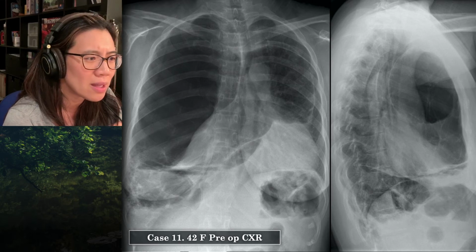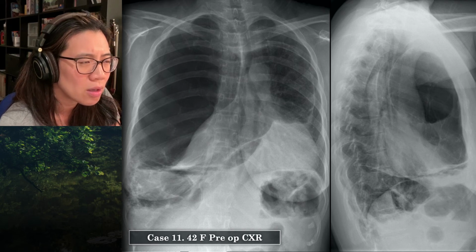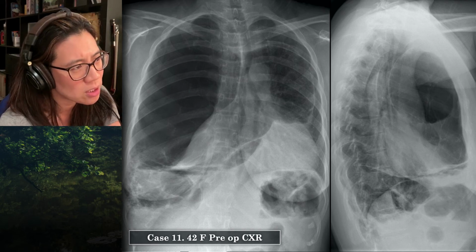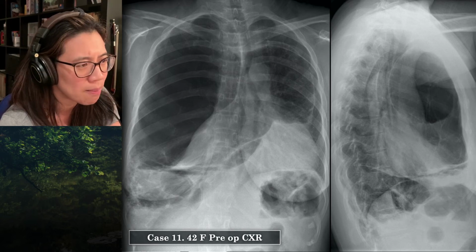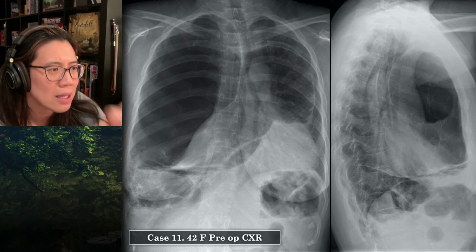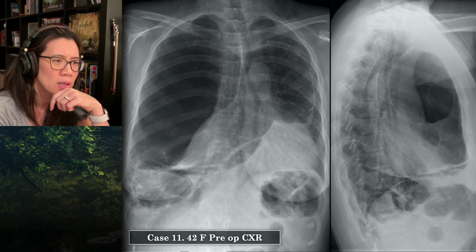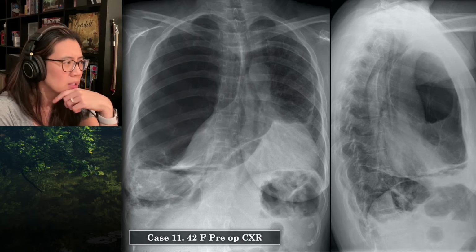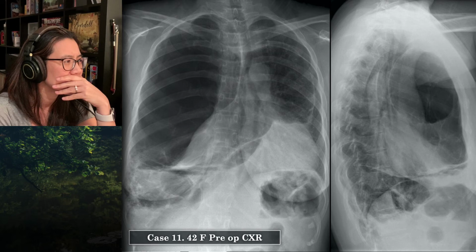And then on the lateral x-ray, there are these parallel curvilinear densities projected over the mid and upper chest, which I'm wondering if they're part of the same process. And on that lateral x-ray, I think I can see more convincingly a rounded lucency associated with that curvilinear density. So I'm not really sure, to be honest. I initially thought maybe it was part of the right lung coming across and that I was catching an edge. If it was part of the right lung coming across, what would that line be called?